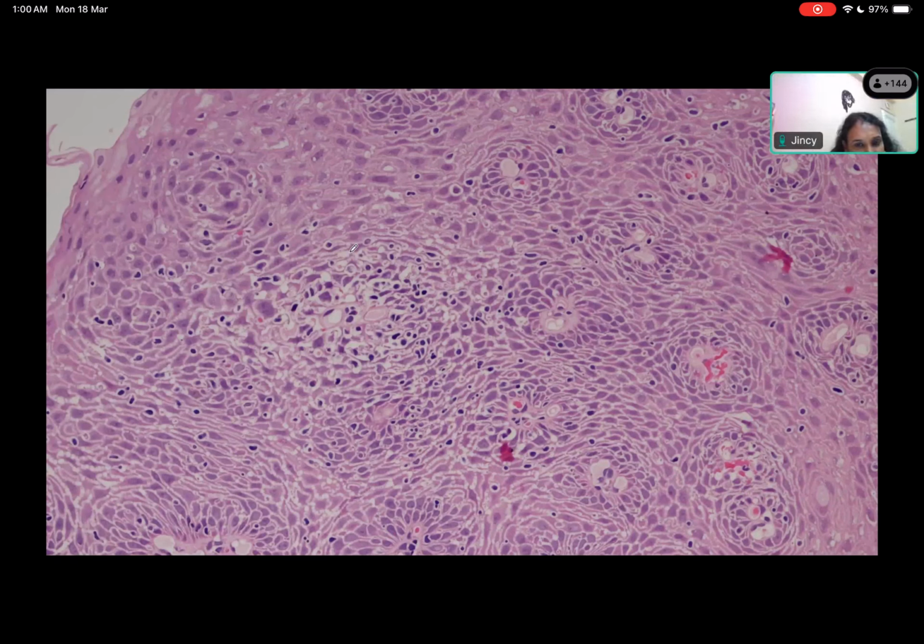Lymphocytic. Yes, these are lymphocytes, right? You cannot see the cytoplasm of the neutrophil. So lymphocytes even in here can become elongated like this. These elongated structures can also be lymphocytes as they're squished in between the epithelial cells. But you are not seeing the cytoplasm that you would see in a neutrophil. So these can be lymphocytes. So then to confirm this, we do a stain.